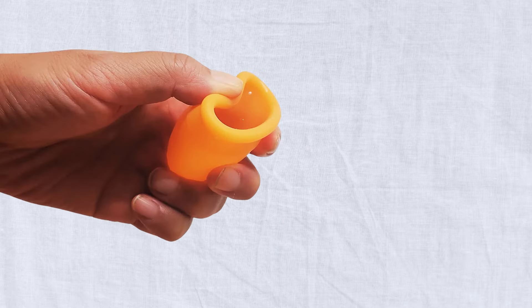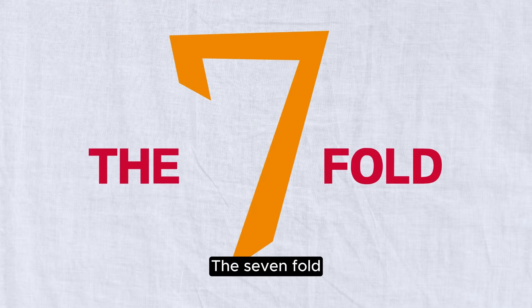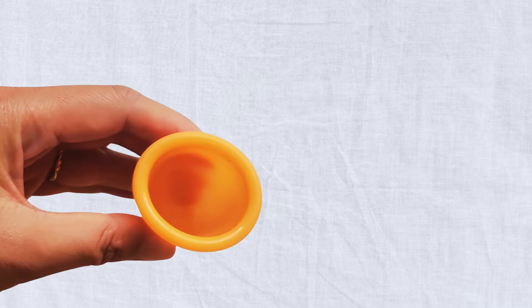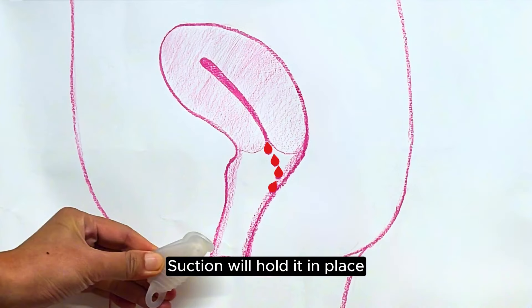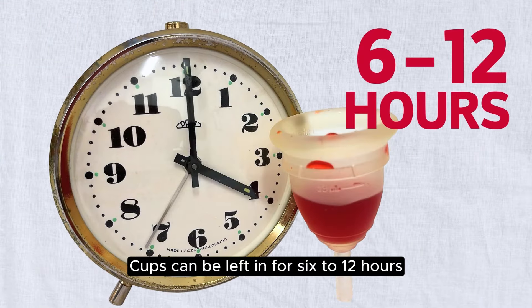The seven fold and the c fold. Use clean hands to insert the cup — suction will hold it in place and you won't feel a thing once it's in. Cups can be left in for six to twelve hours.